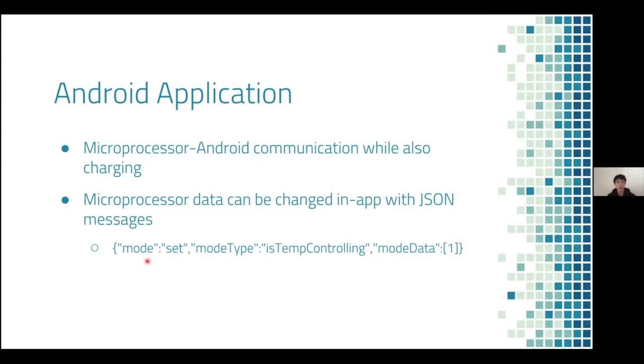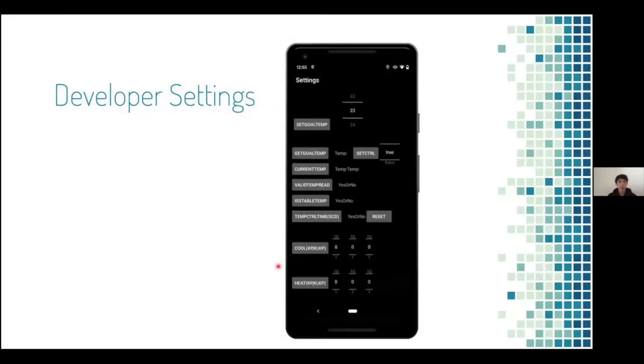Here is our example JSON message. By sending this message to the microprocessor, it can change our hardware system to temperature control. So we can change the temperature by app. Here is our developer interface. The interface can change the parameters of the temperature control, such as set the goal temp or changing the cooling or heating PIDs.